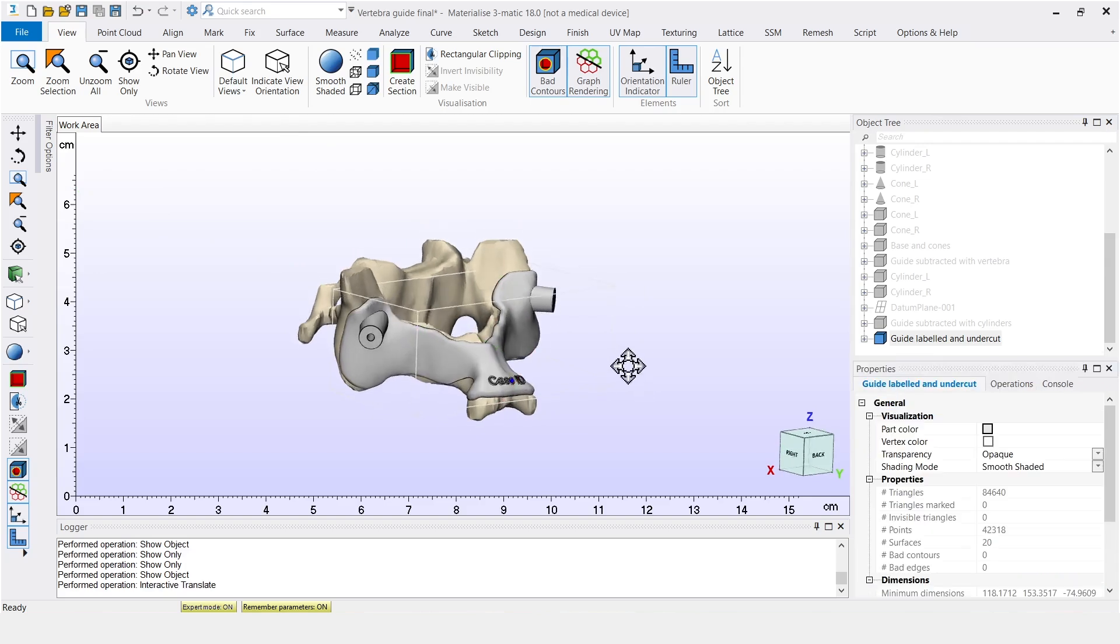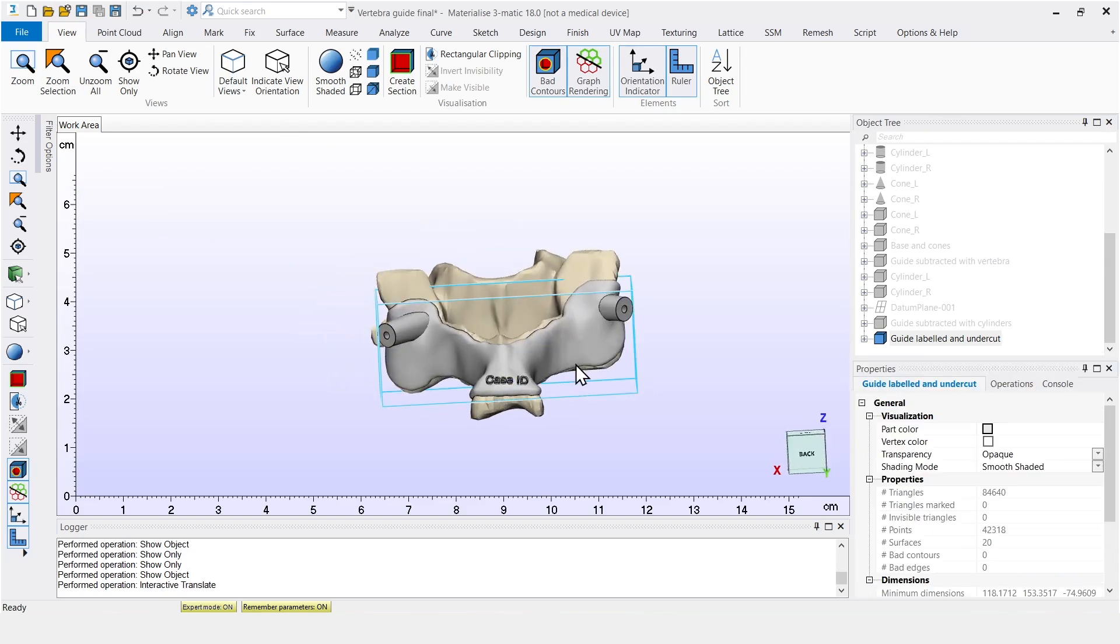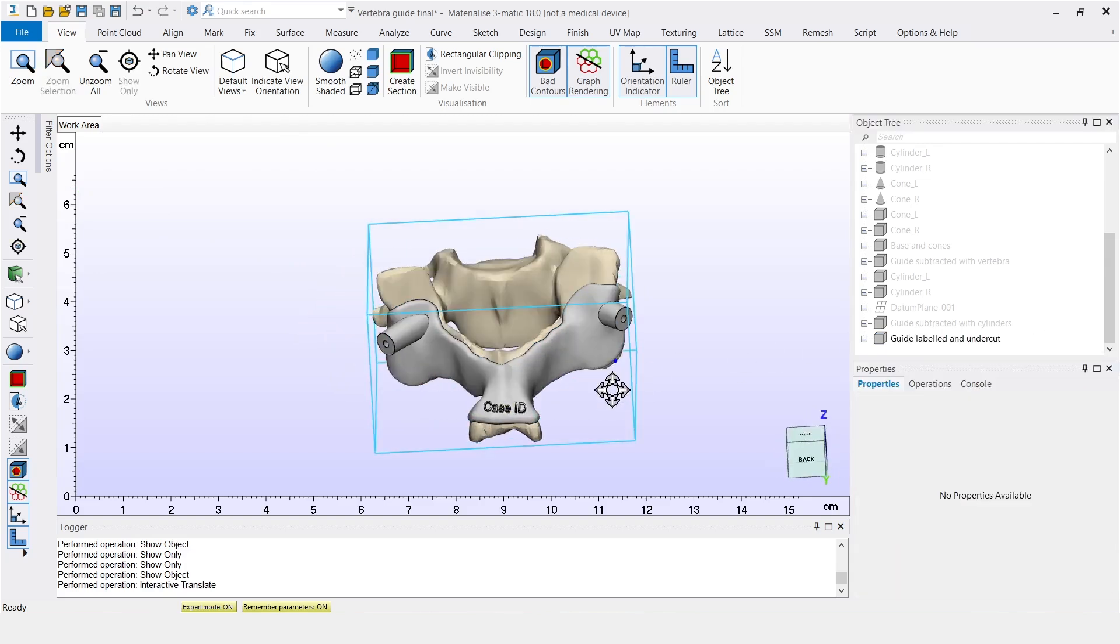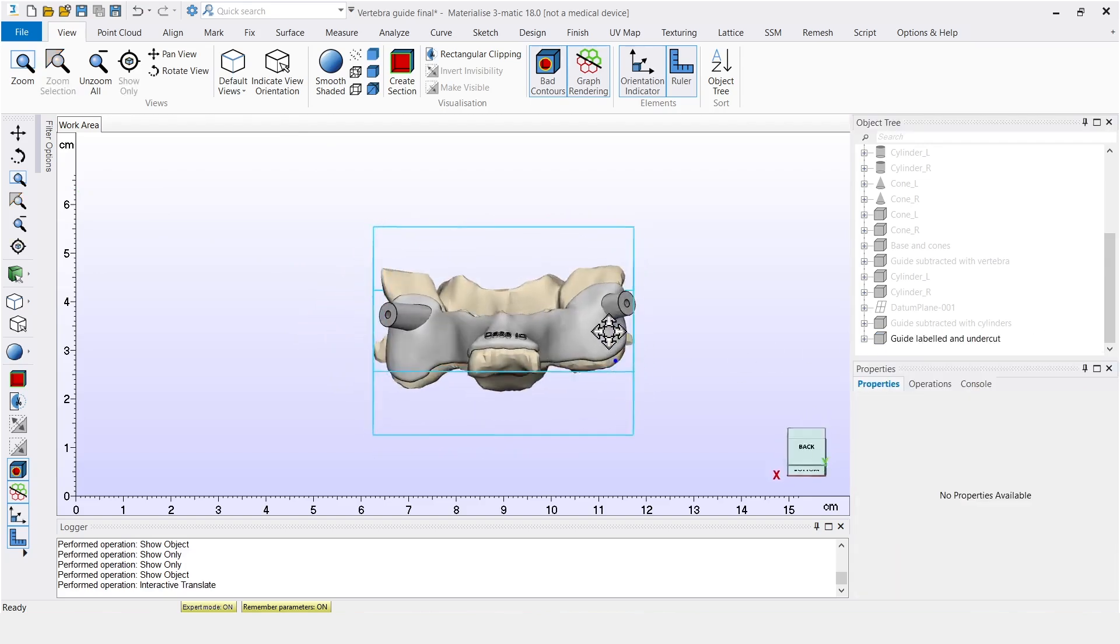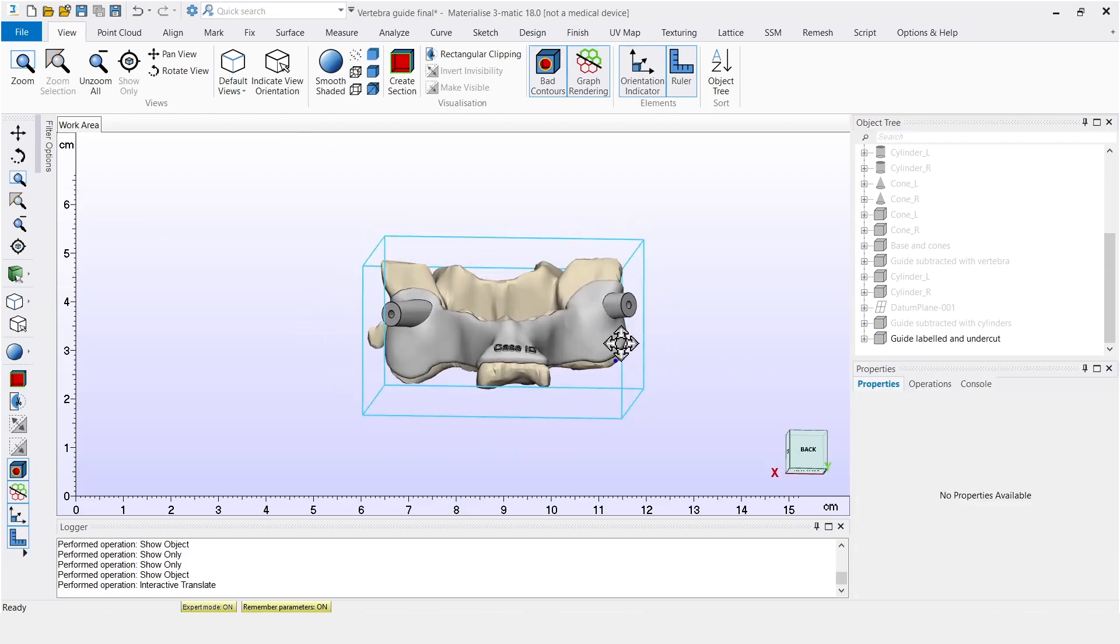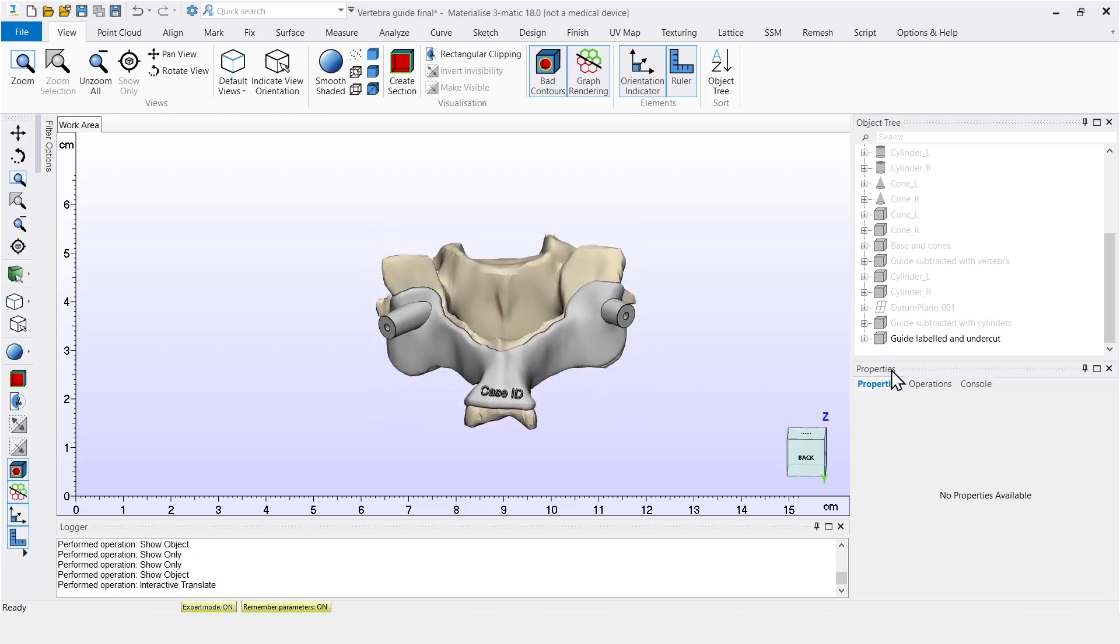The final design of the guide, together with the vertebra, looks like this. So here I just quickly showed you the intermediate steps to give you an idea of the design process. But typically, these steps take around 15 to 25 minutes, depending on your proficiency in 3matic.